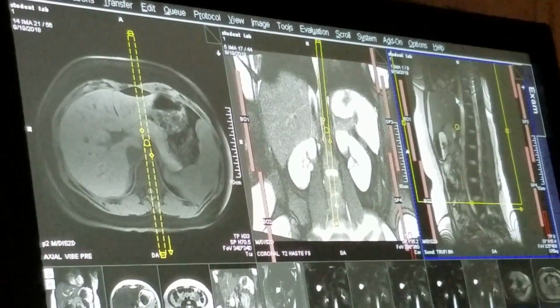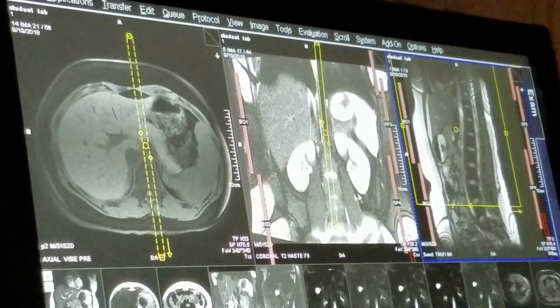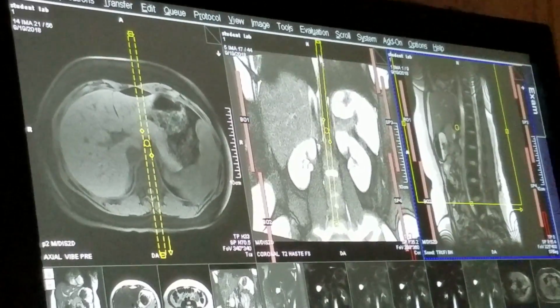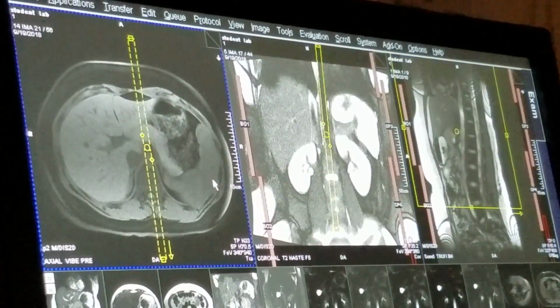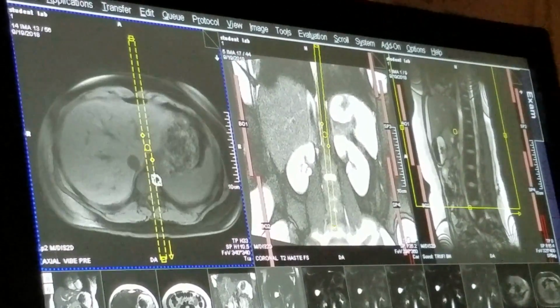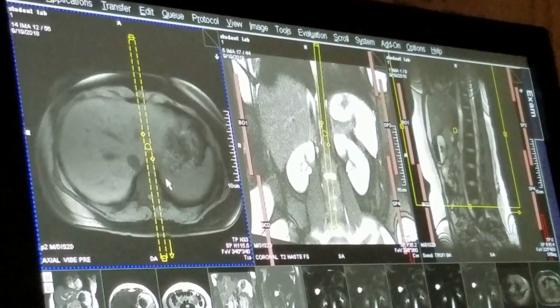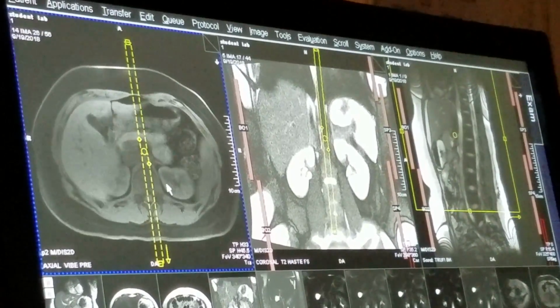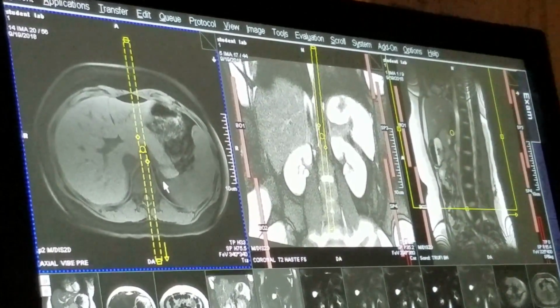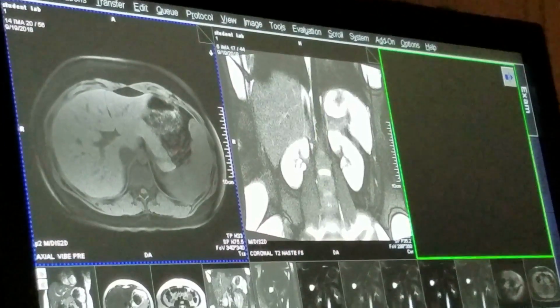Great. Okay, so positioned our sagittal slice up through the aorta. You can always look on your axial images, and as you can see, the aorta, as I scroll up and down, is maintained in the middle of my slice. So now we'll apply this.